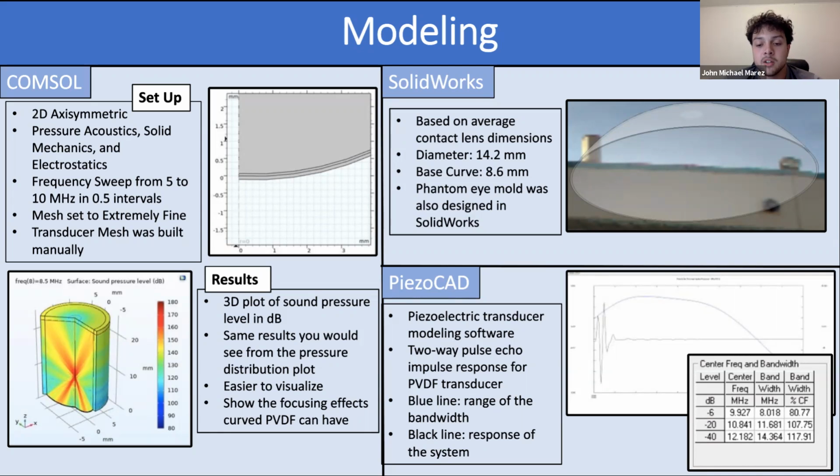For the SolidWorks modeling, we created a contact lens shape that the PVDF would be shaped into. The diameter and base curve of this model are shown in that section. The modeling team was also able to experiment with a software called PiezoCAD, which is a tool for rapid iterative transducer design application. The thicknesses for the transducer matching layer were the same as set in COMSOL.